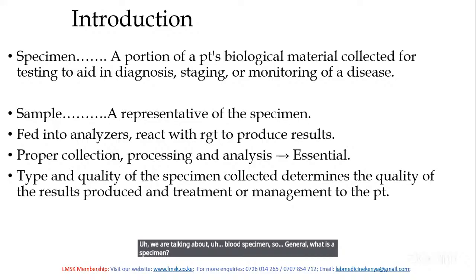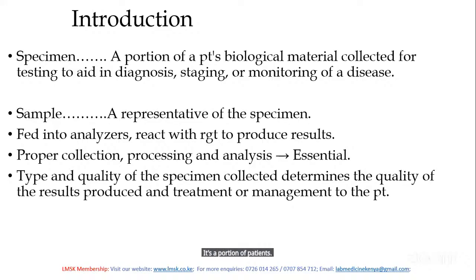It's a portion of a patient's biological material, which is collected for testing, and the aim is to aid in diagnosis, staging, or monitoring of a disease. Biological material can be blood, sputum, body fluid, etc. Just a portion from the body will be a specimen.